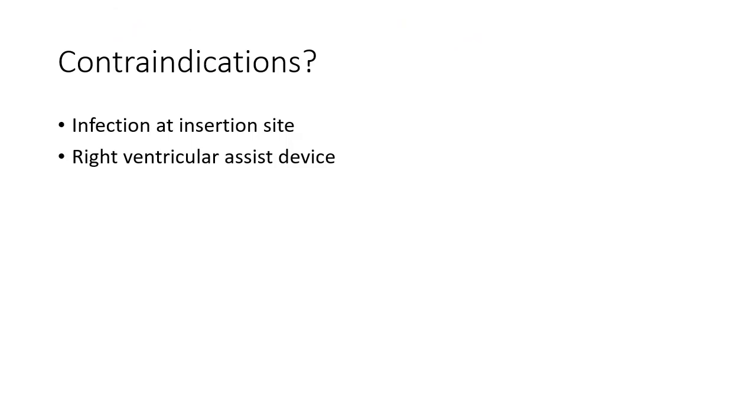So what about the contraindications to the procedure? Most contraindications that you may read about are relative.